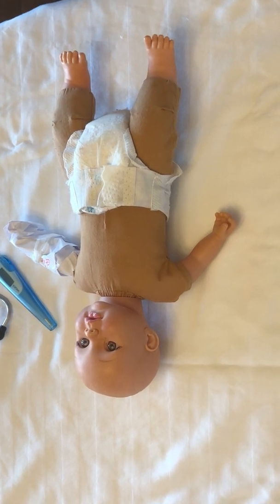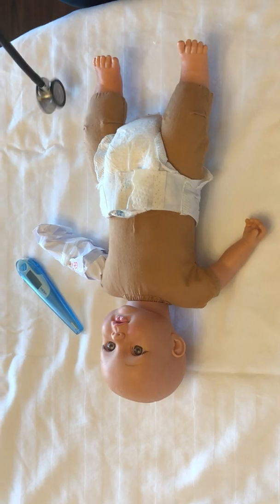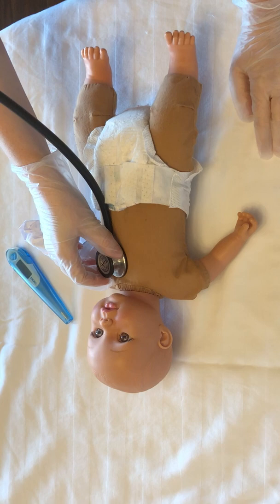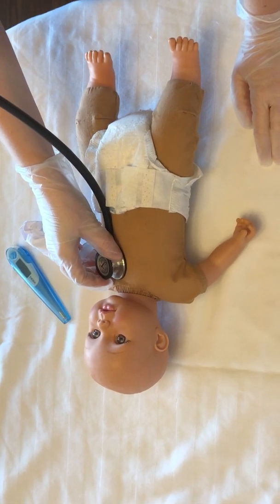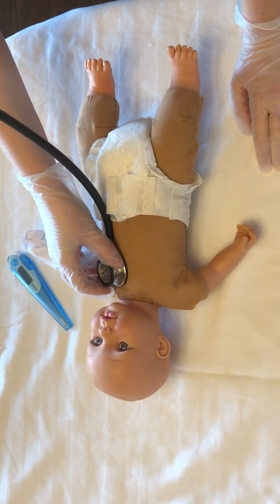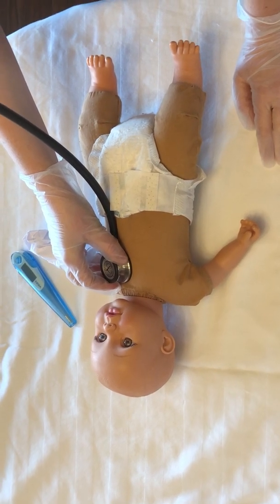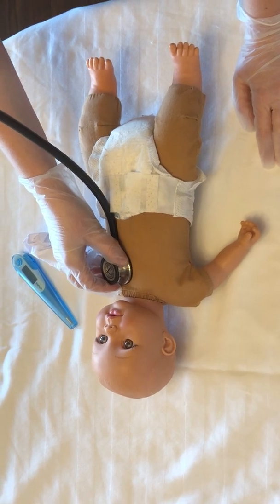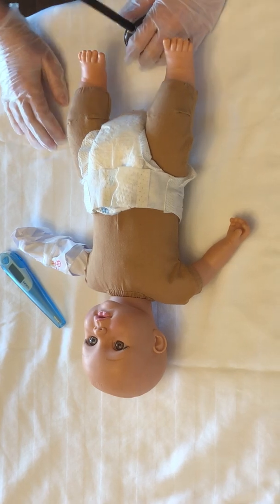So the first one we're gonna take is the apical pulse. Got our stethoscope here. So we're gonna listen for 60 seconds, and the apical pulse of a baby should be between 120 and 180 beats per minute, depending on whether they're resting or agitated. We're also gonna listen for the S1 and S2, and any other heart sounds if there are. After that, once that's finished, then we're gonna check their respiratory rate.